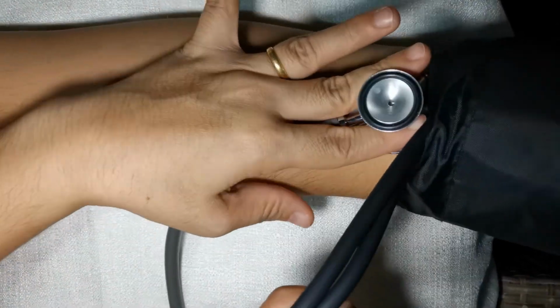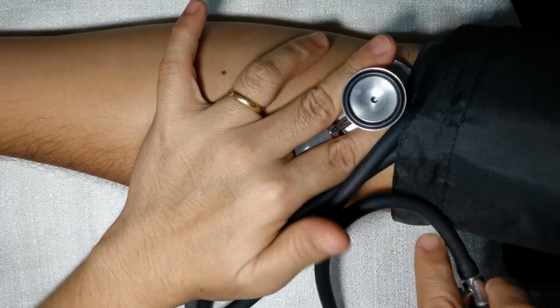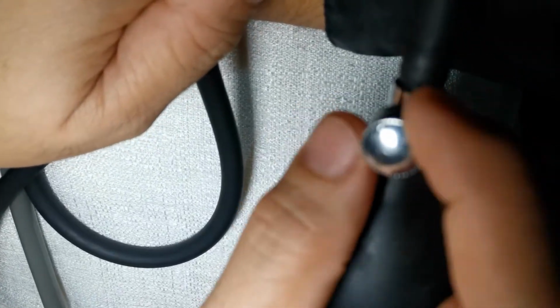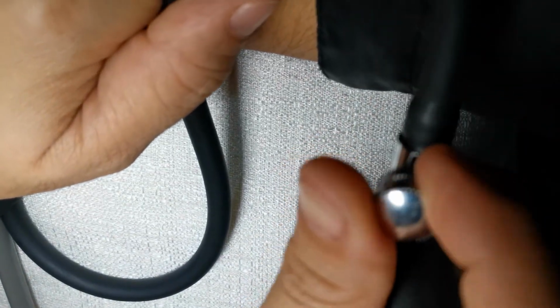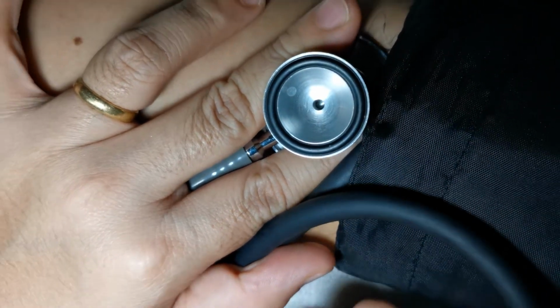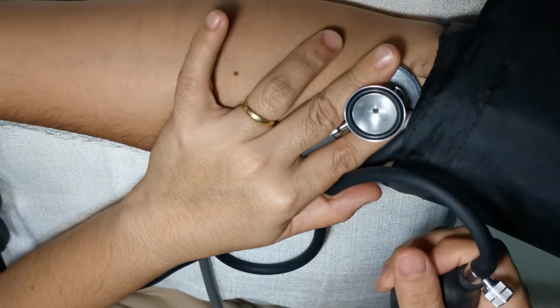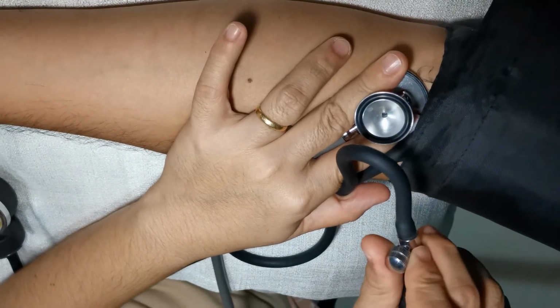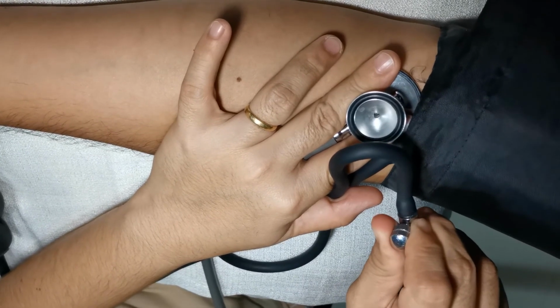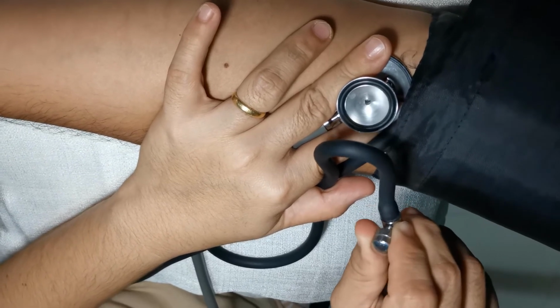Place the diaphragm on the brachial artery. Tighten the screw of the valve to close it. Turn it clockwise. Inflate the cuff until the dial points to 30 mm of mercury above the radial pulse. Slowly deflate the valve at 2 to 3 mm of mercury per second and listen for the first beat, that is your systolic. And record the last beat of blood flow, that is diastolic. And then deflate the cuff completely.